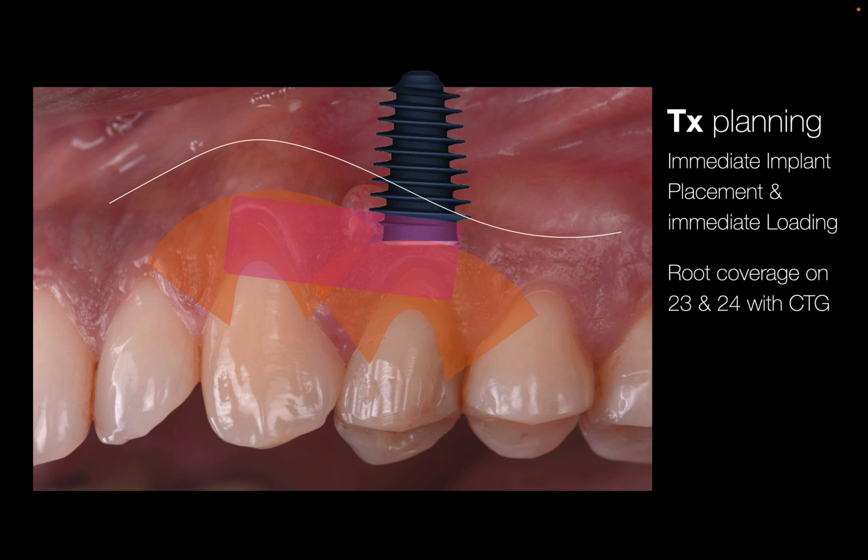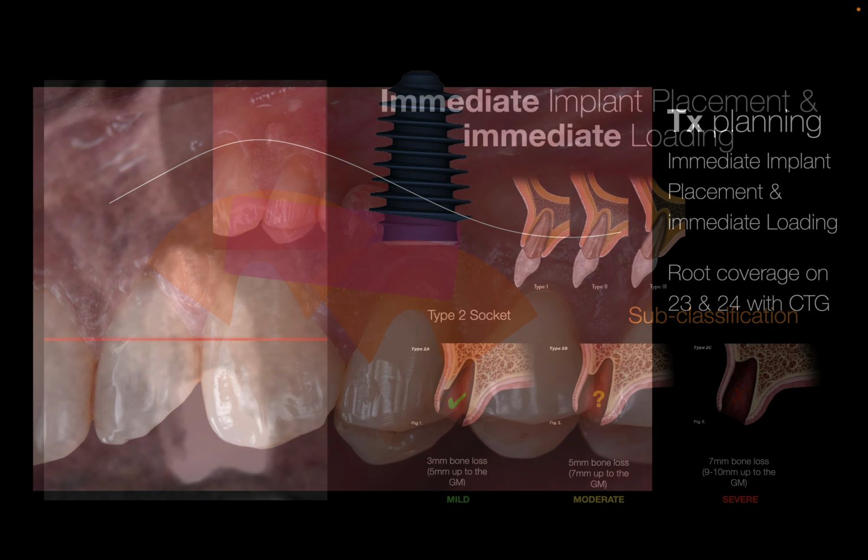Because right now you have a problem inside, but whenever I extract this tooth and I place my implant, I'm going to create a very clean area to receive my implant, my bone graft, and then my underlying soft tissue that is going to isolate the clean area from the dirty area, which is outside. So the connective tissue graft will also be used to separate and to isolate the problem and reinforce and help to heal the wound created by the fistula.